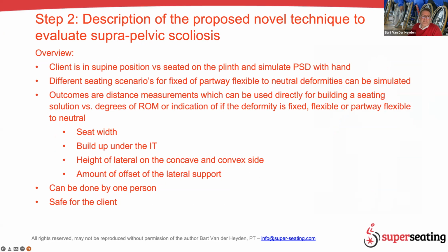So as I just mentioned, the technique is in supine versus seated on a plinth, which most clinicians use, most colleagues use. And then you simulate your postural support devices with your hands, and that makes it a really difficult process to actually determine the exact distances and heights and measurements of the system. That makes it really difficult.